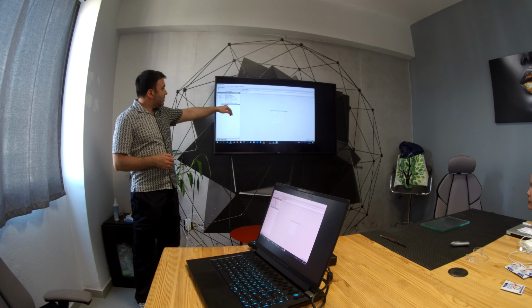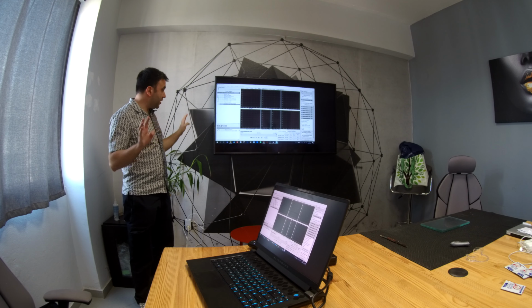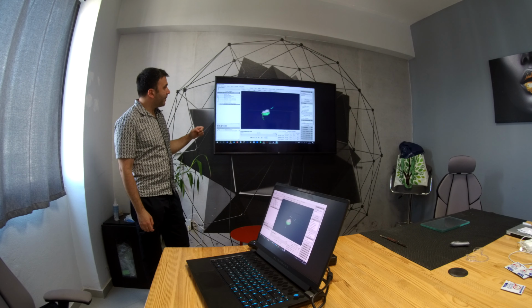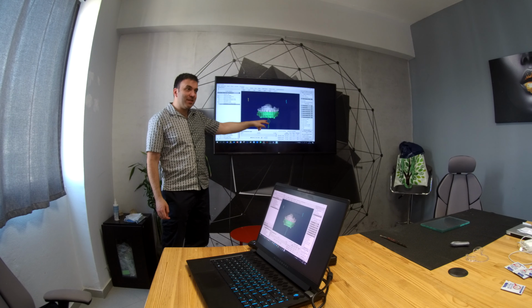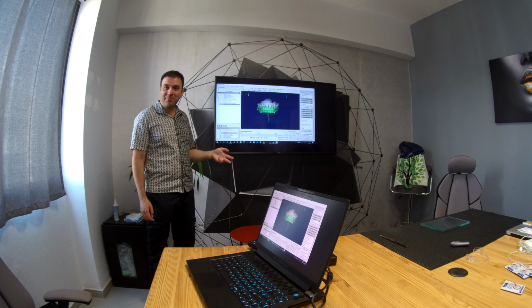So complex diagnostics, and here you use models and axiography. No CBCT here. He doesn't need it. Okay, it's his decision. So we see the joints, we see the trajectory. You see here is a click. Yeah. This is a classic picture of the click. It's very lucky when you see one. It means it's a fresh click of a young patient.